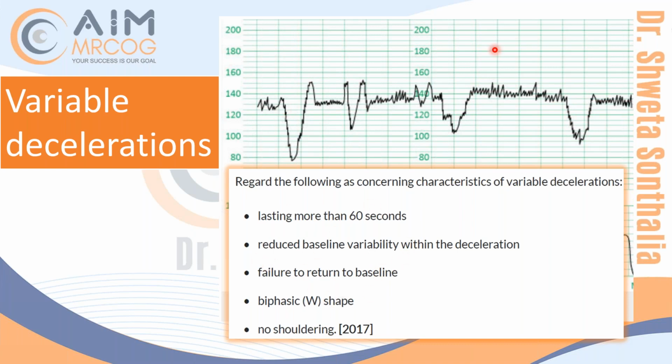If you don't understand that, you cannot apply this here and you will not be able to label the CTG abnormal, pathological. Because with concerning characteristics, can anybody tell me what is pathological with concerning characteristics? How much time, how many contractions? More than 50% of contractions over 30 minutes. More than 30 minutes or 30 minutes? 30 minutes or less if there is any maternal or fetal concern. Yes. So this is very important. 30 minutes or even less. And more than 50% of contractions, right?